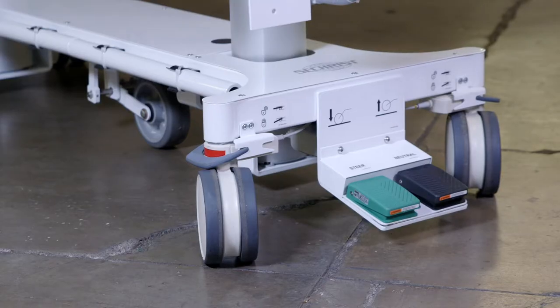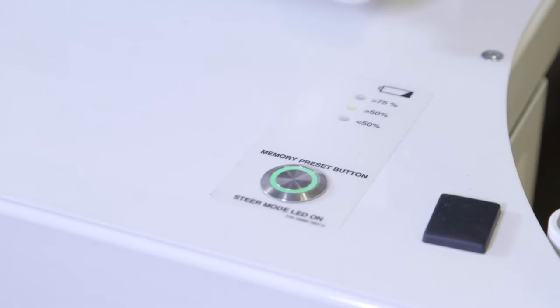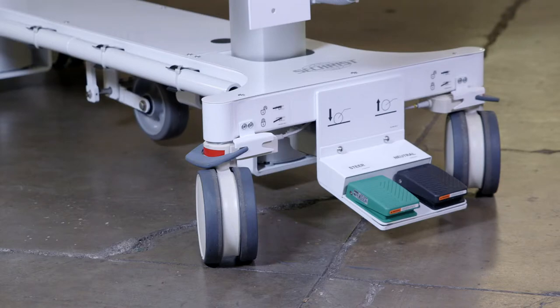To go back to neutral, simply press the black neutral button. Your green light will disappear and your fifth wheel will raise off the floor.